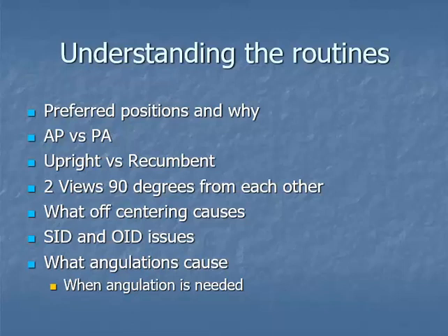So I've worked with radiologists who came to us from pediatric hospitals who told us that fundamentally there's no real difference in perceived heart size in children below age 7 shooting AP versus PA. The radiologist should know that the heart is going to be big on kids from 7 years old or under.